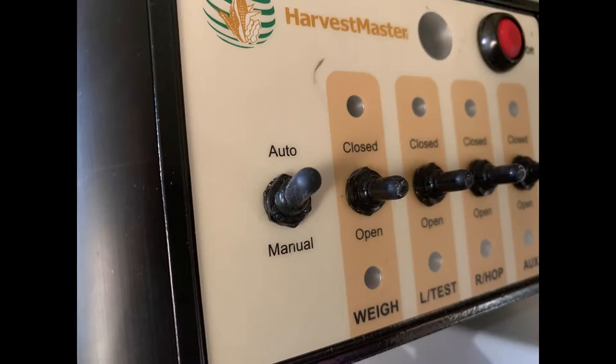Be sure the system console toggle is set to auto. Doing this will help to ensure that the system is starting fresh.